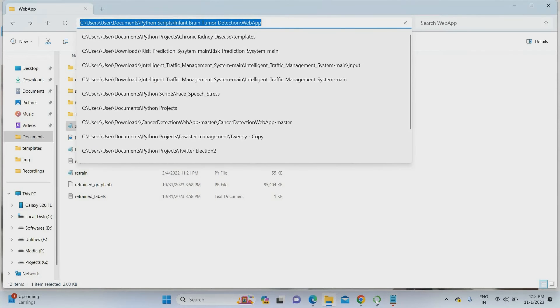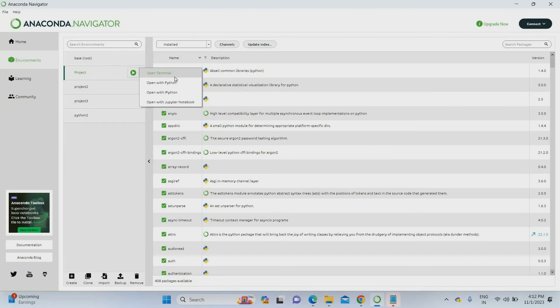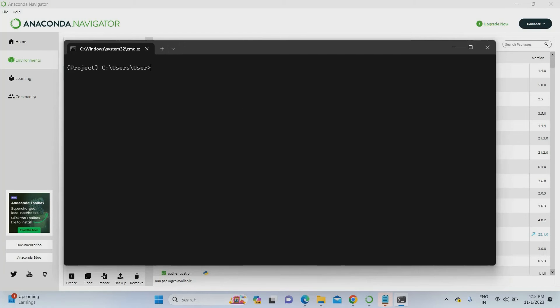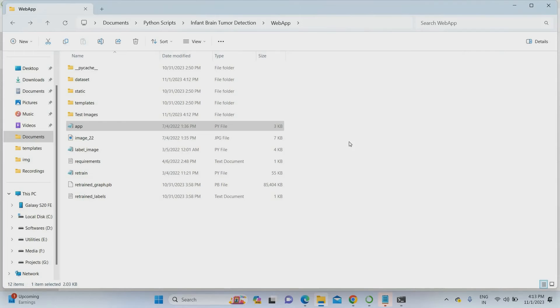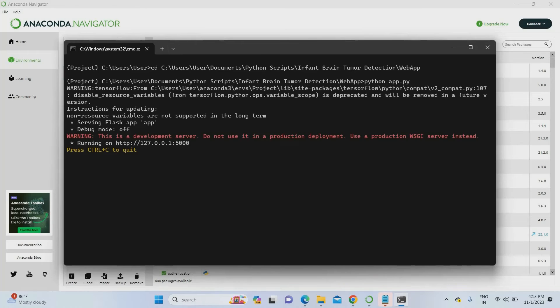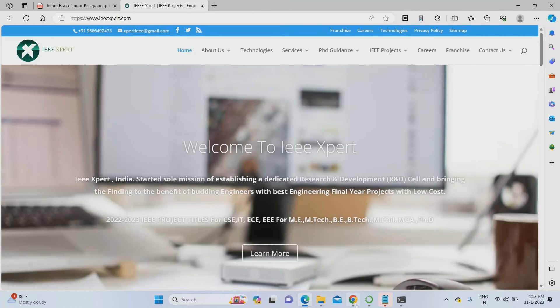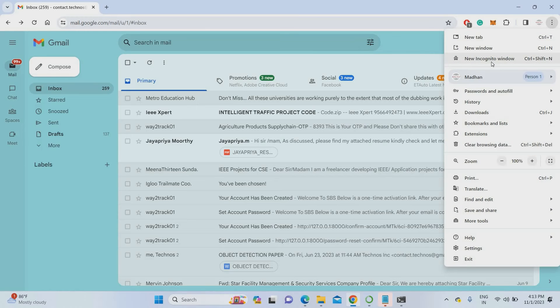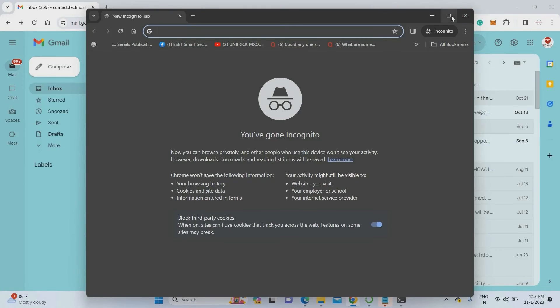I am copying the project location and opening my Anaconda Navigator, accessing my project environment. In the project terminal, I am going to do 'cd space project location' then Enter. Then I am going to run app.py using the command 'python app.py'. Once the project compiles, it will create a website for this project and you can find the website link after completion. I am waiting for it to compile. Once compiled, it will run as a website on a local server. I am copying the server address and pasting it on the browser.